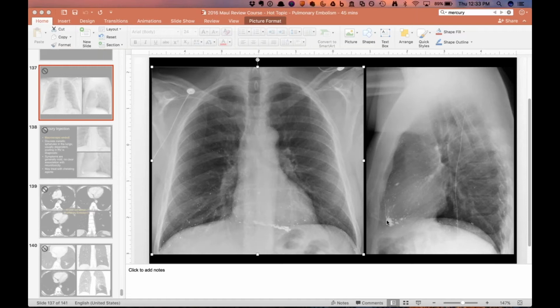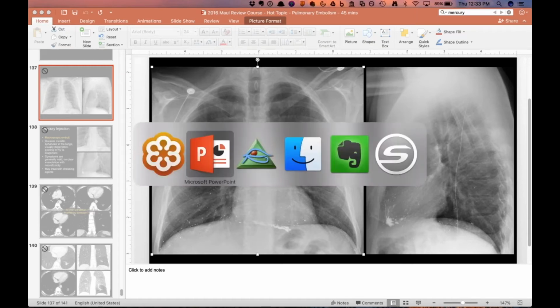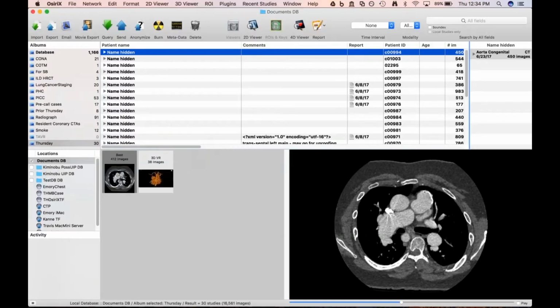And so I have no idea how long that stuff actually stays there like that, but it's very similar to your case, David. Yeah, that's a great example. Thanks for pointing out that RV thing. Yeah, that's what I remember from this case.